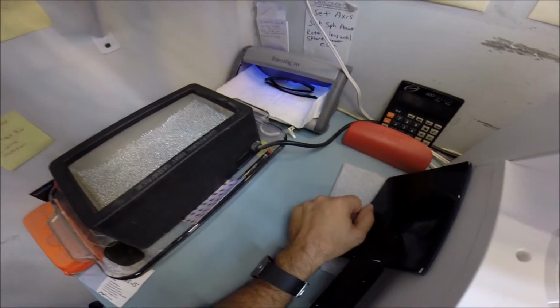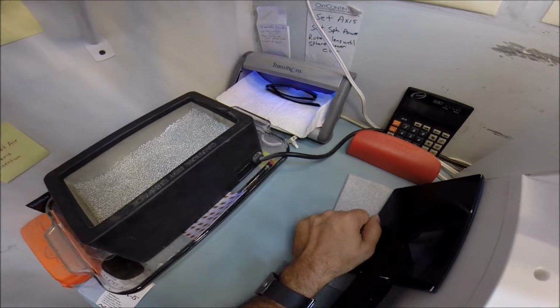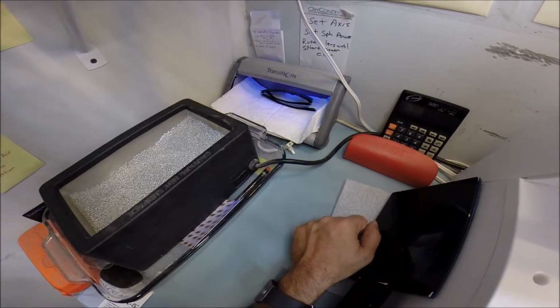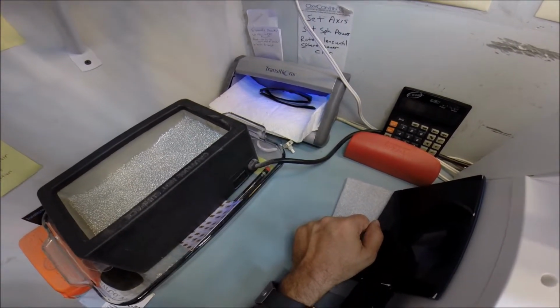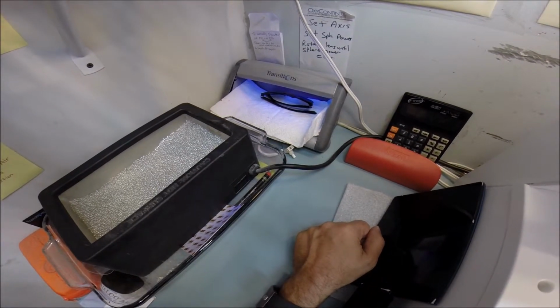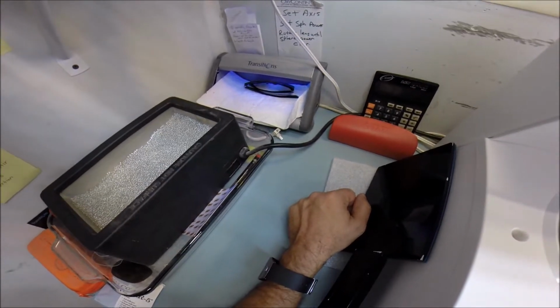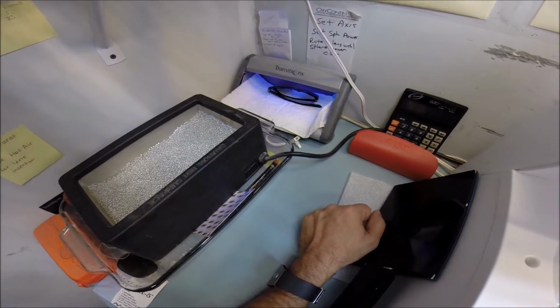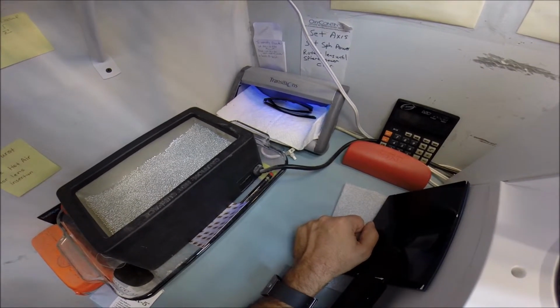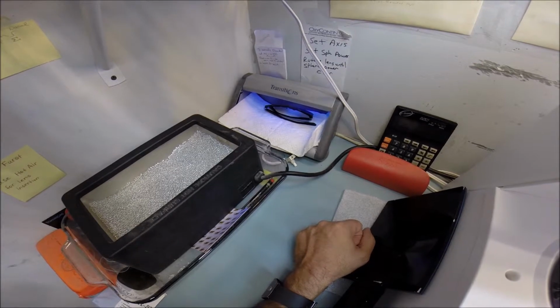And this is important, Tyler, pay attention. All transition lenses will turn dark on day 1. Give them 2 weeks. They will continue to darken every day for the first 2 weeks until they get to their final setting. After that, they will work for years with maximum performance. The only time they will not work is if you're behind the windshield in a traditional car. Your windshield absorbs all the sun's ultraviolet light, so your dashboard does not crack from sitting in the sun. That's why transition lenses don't turn dark in a car. Now, if you have a convertible or a motorcycle, they will darken.